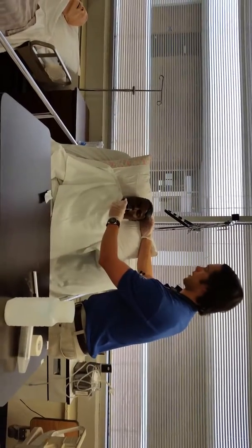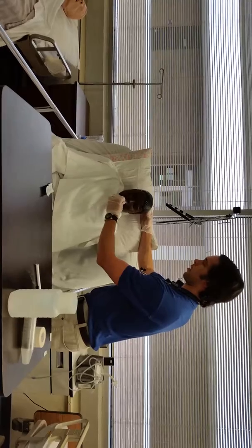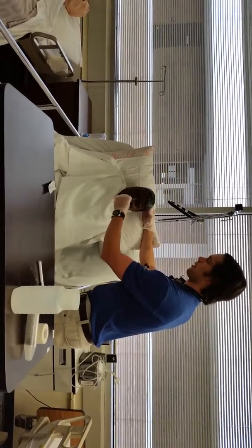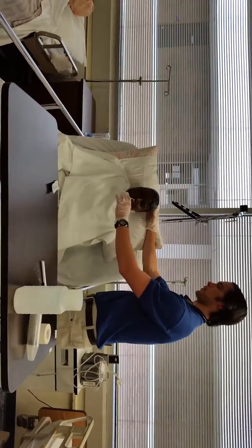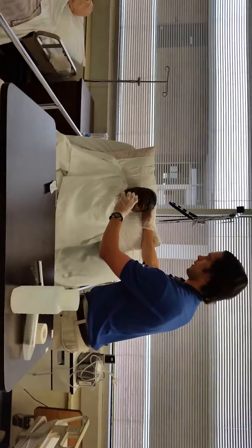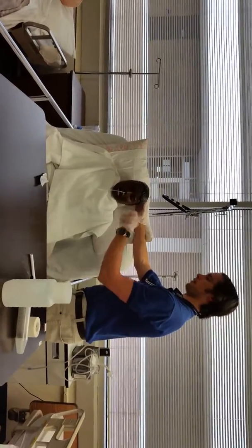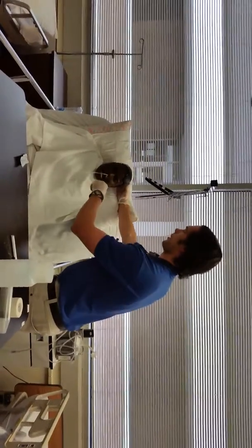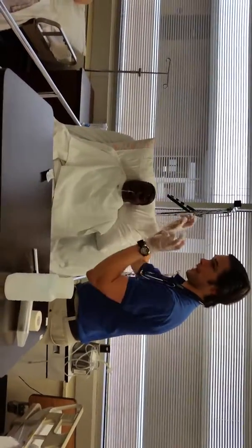Now I would have them tilt their head forward, and have them swallow repeatedly, swallow, swallow, swallow as I advance the NG tube. If there was any resistance, I'd put slight downward pressure and try to advance. If it didn't work, then we would try the other naris. But just for demonstration purposes, this one is in.